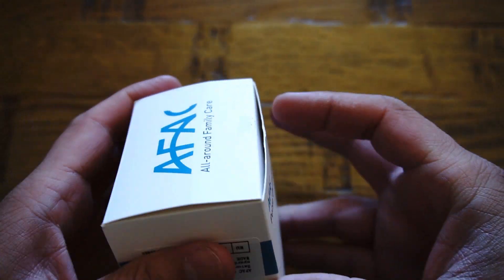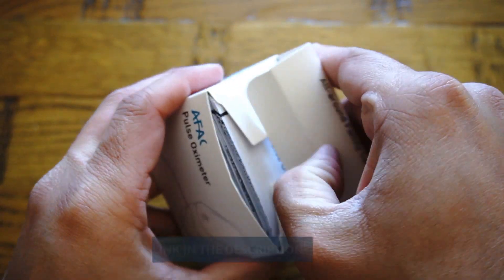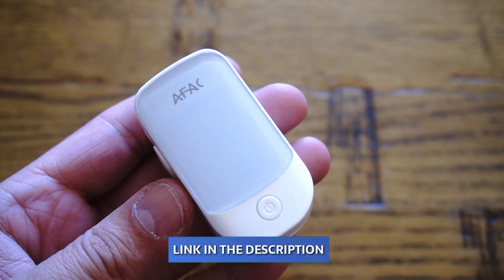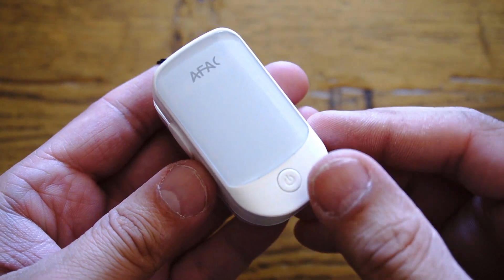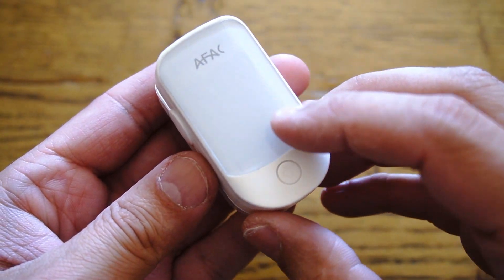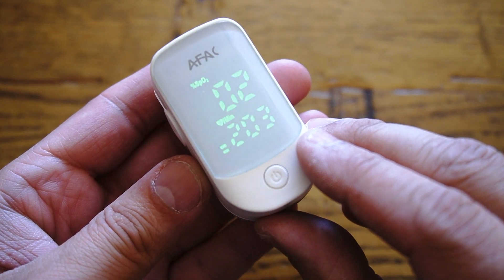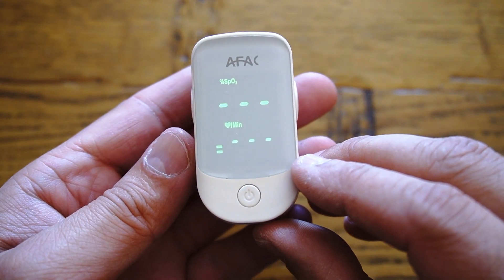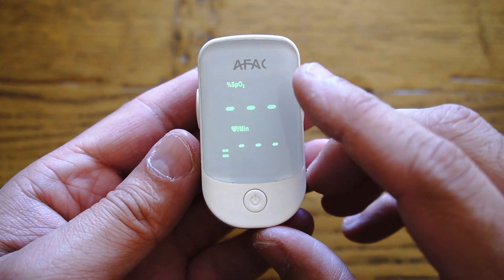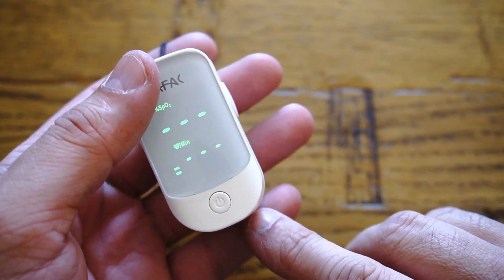With the help of this pulse oximeter you can actually measure SpO2, which is blood oxygen saturation level. Normally in a healthy person it falls between 94 and 100 percent — usually you'll see it about 99 percent. When your levels go lower than 90, it's not good at all; you've got to get yourself checked.